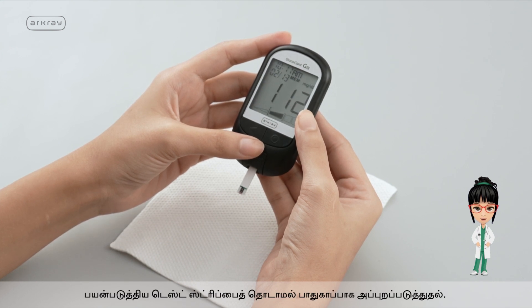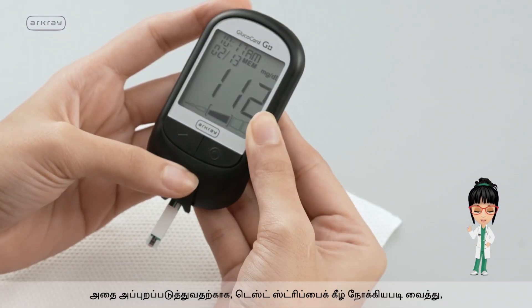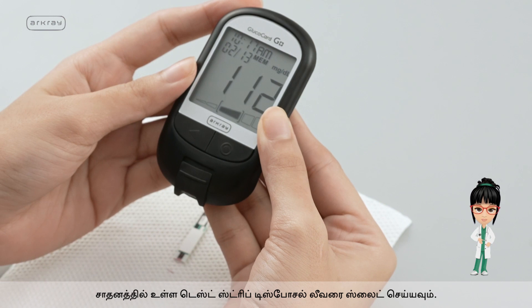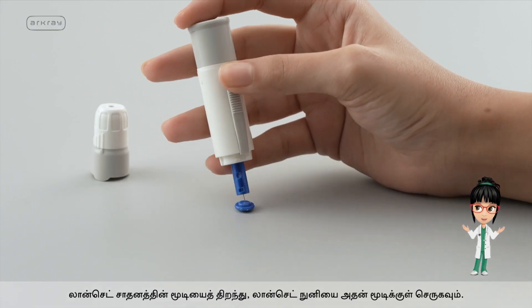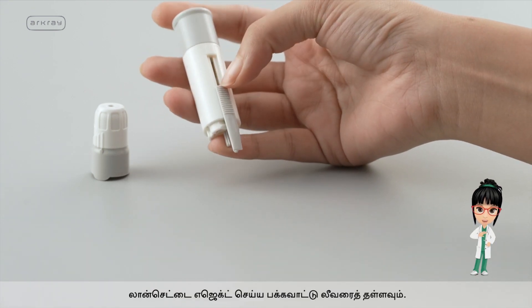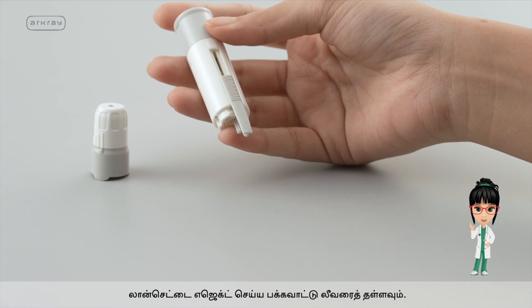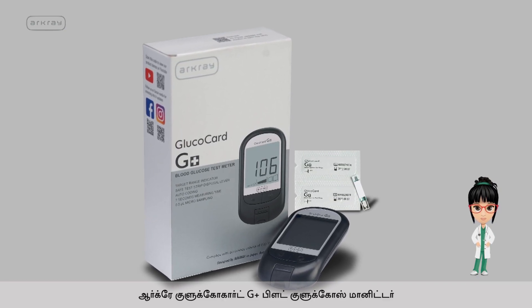Dispose of the used test strip safely without touching it. Point the test strip down and slide the test strip disposal lever on the device to eject it. Open the lancet device lid, insert the lancet tip into its cap, and push the side lever to eject the lancet. R-Cray Glucocard G Plus Blood Glucose Meter.